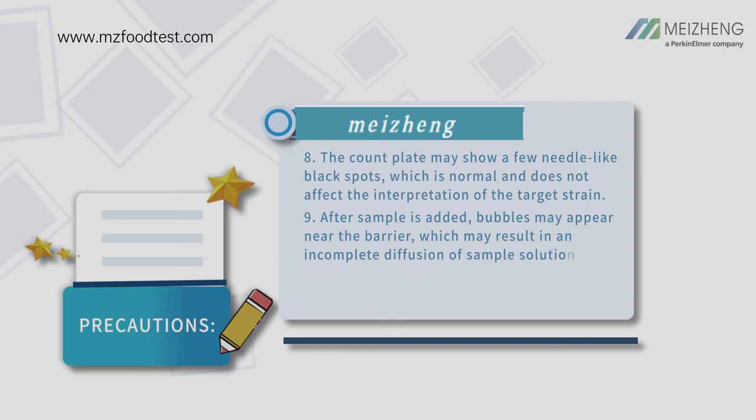The count plate may show a few needle-like black spots, which is normal and does not affect the interpretation of the target strain. After sample is added, bubbles may appear near the barrier, which may result in incomplete diffusion of sample solution. This is a normal phenomenon and does not affect the test results.